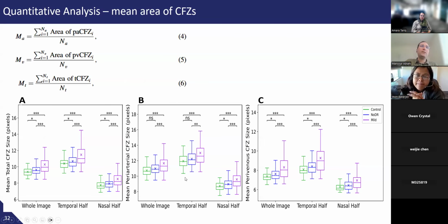Yeah, generally, this statistical analysis shows that these biomarkers are promising and can be used for the classification. If the differences between them weren't significant, we could not use them for the classification. But when we are seeing significant change, this is promising. We can collect all of this information and give it to some traditional machine learning algorithms such as support vector machine, decision trees, XGBoost, and different algorithms.